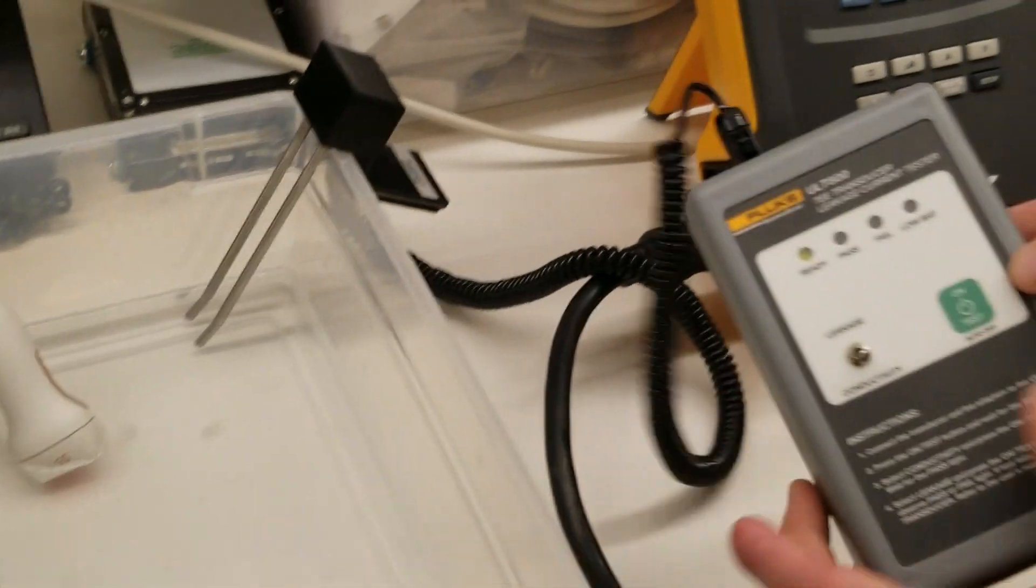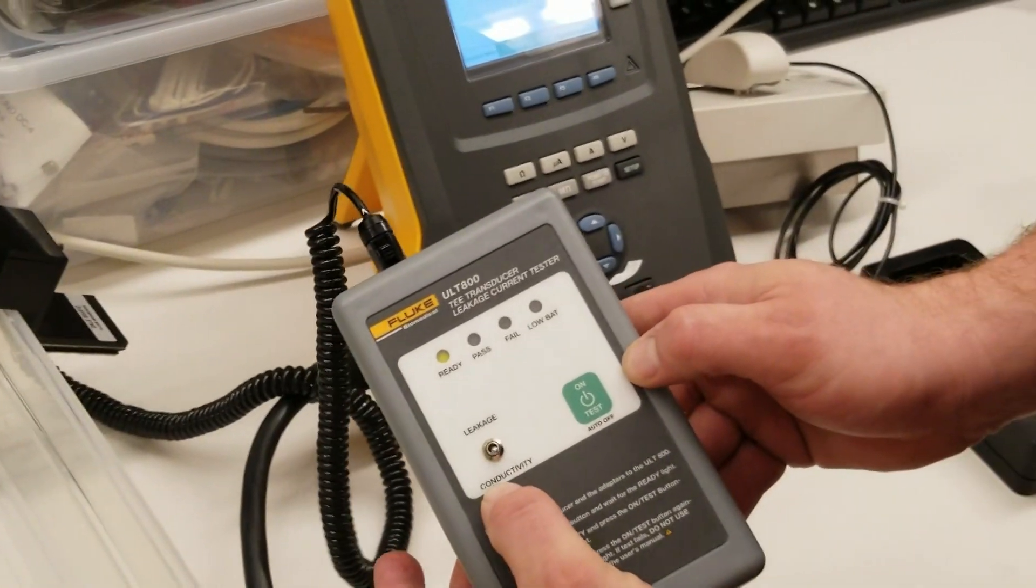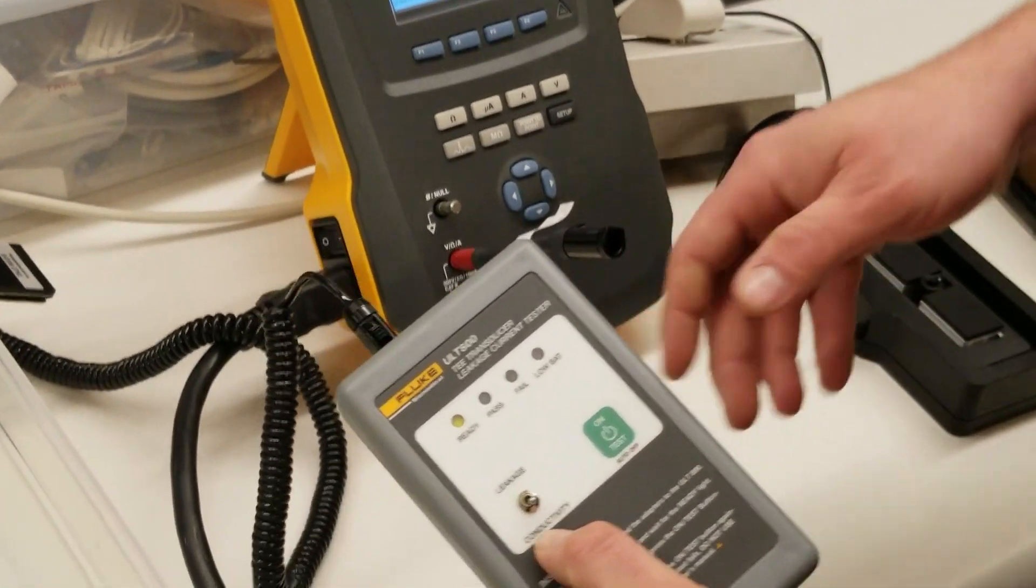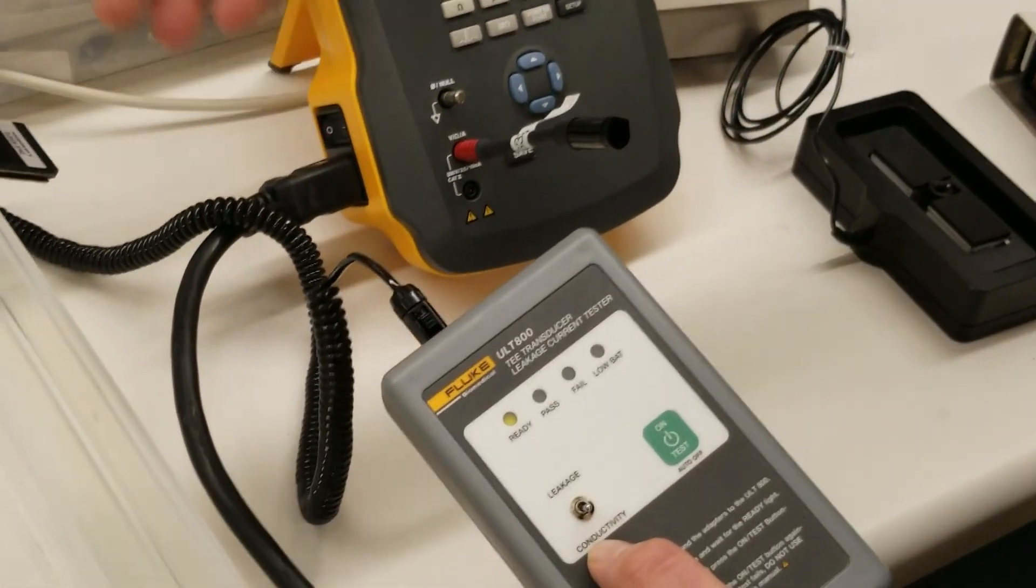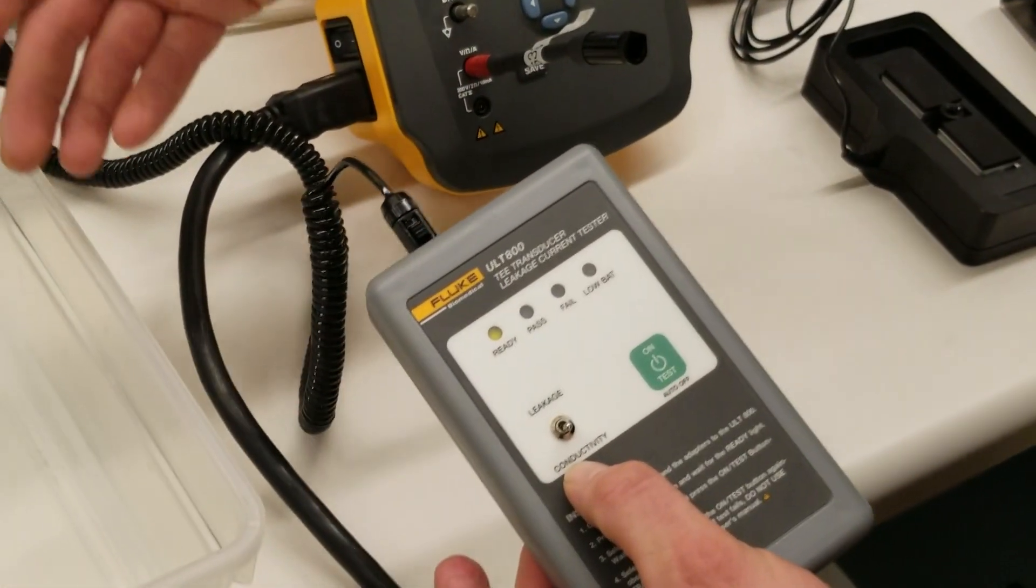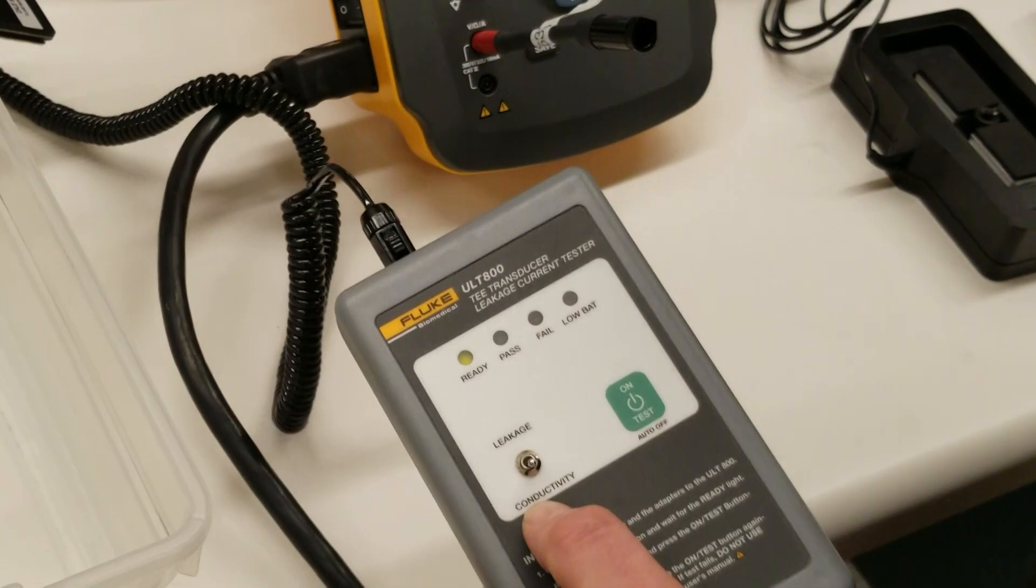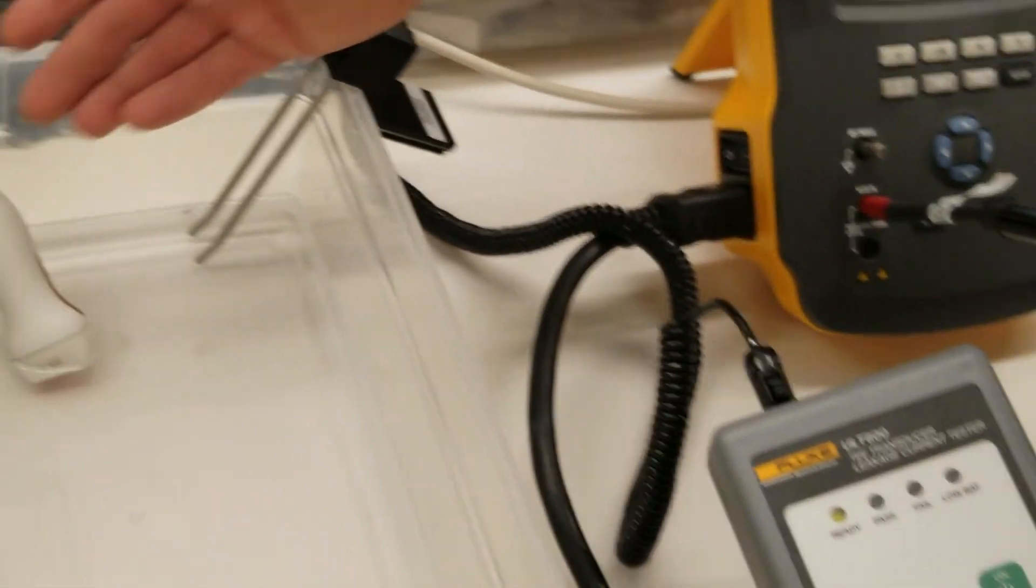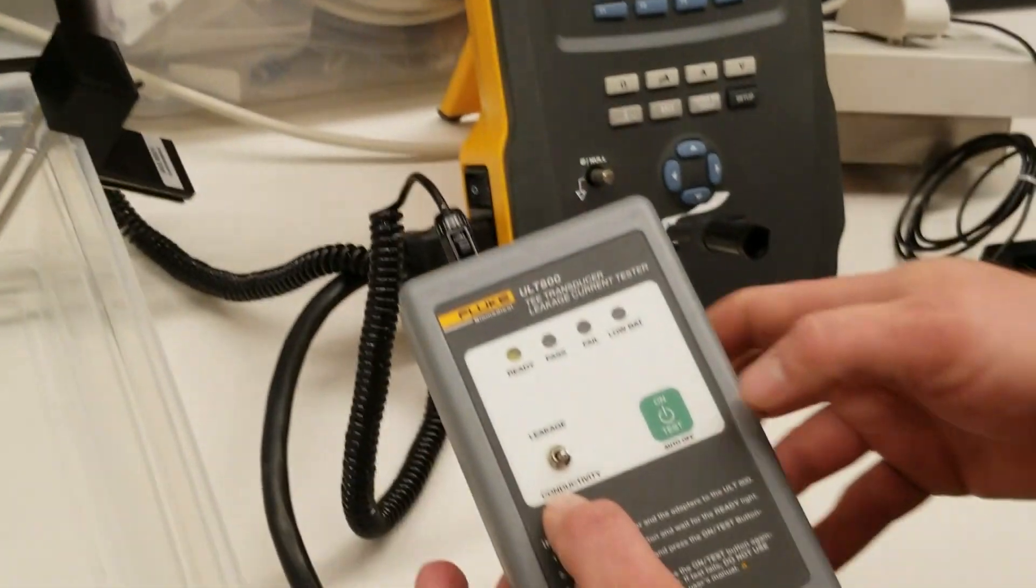We're going to get your ULT 800 and check conductivity. That's the way we're going to verify that it's conductive enough to get the electricity to pass from the probe to the 600-212.